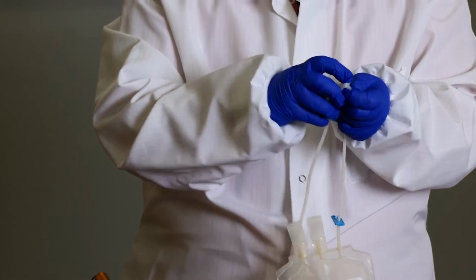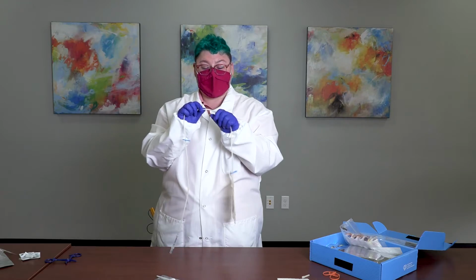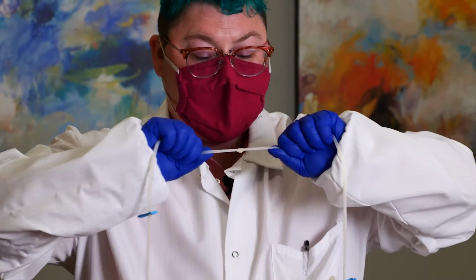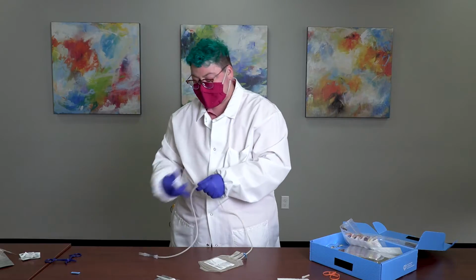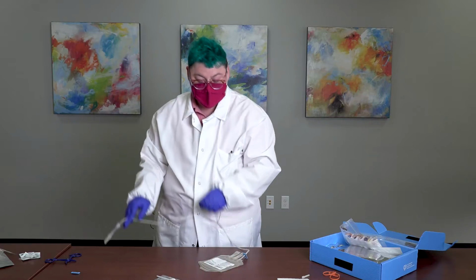Nothing fancy with this knot, it just needs to be basic. The purpose of this is to prevent any of the blood from leaking out of the bag, and as mentioned earlier, prevent air contamination. You want to pull this tight to prevent any blood from getting from one side to the next. The next thing you'll do is tie a second knot 1 inch down from the first knot. This provides an extra sense of security. At this point, the needle can be cut and then discarded into a sharps container.